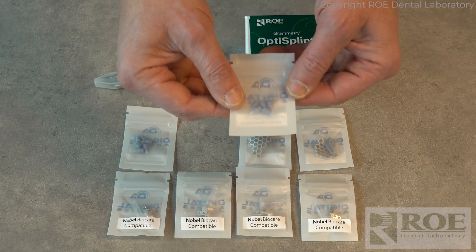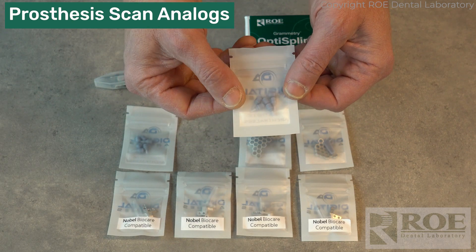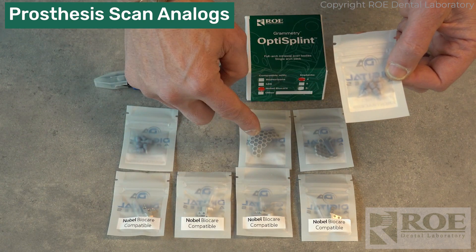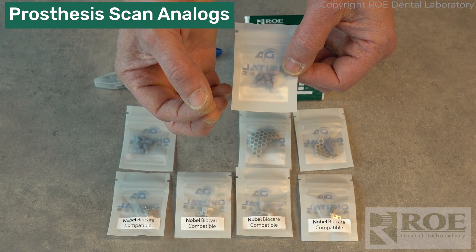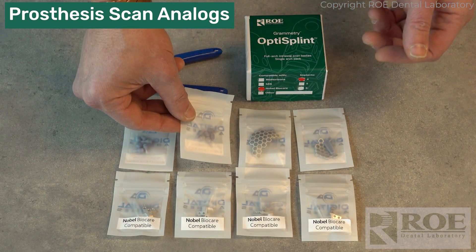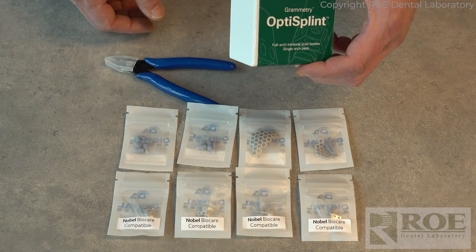These are what they were calling arch tracers on the package, but they're really scan bodies and this is for the restorative phase. The OptiSplints are all surgical, and these are restorative — you plug them into the intaglio of the prosthesis, inside the temp cylinders, to scan. It gives us a reference when we're scanning. Those are the items inside an OptiSplint kit.